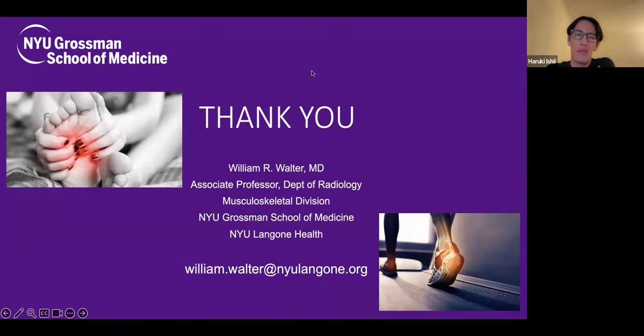Good, thank you. I know you didn't have time to talk about it, but in terms of Lisfranc injuries, would you recommend getting an MRI? Is there any reason that you would get it on the weight-bearing MRI for the Lisfranc injury? I know that for the X-ray, you want to get it weight-bearing to see if there's any gapping of the second metatarsals, but is there any point of doing MRI weight-bearing? Is it better to get a CT for the assessment of Lisfranc injuries? What's your opinion of that?